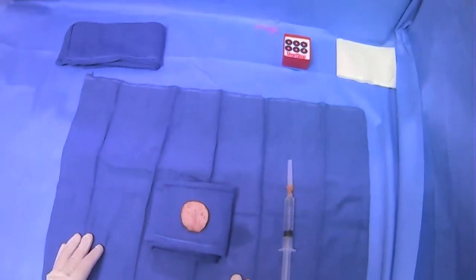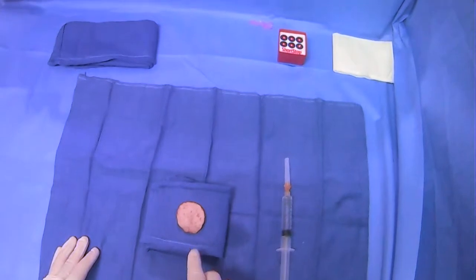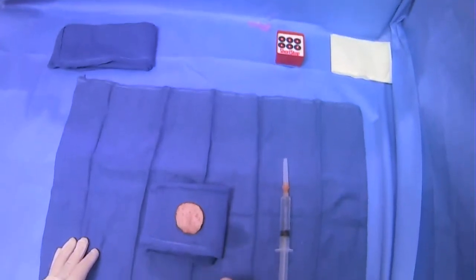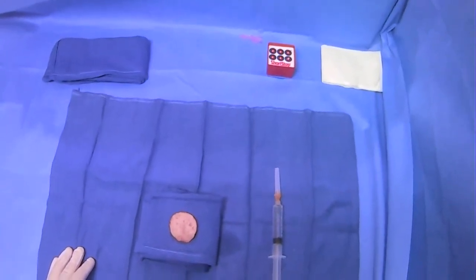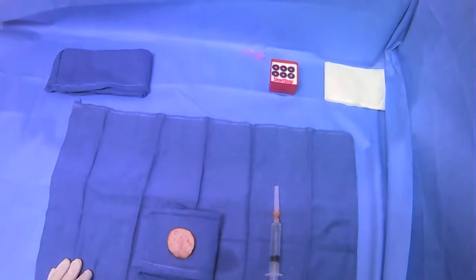All right, so we're going to focus first on making the wheal, and then we can talk about some other things about administering lidocaine. But the wheal is especially important, and just remember, making the wheal, it's an intradermal injection, kind of like placing a PPD, and that's important because that's where the pain receptors are. So it's really important to anesthetize that layer well.